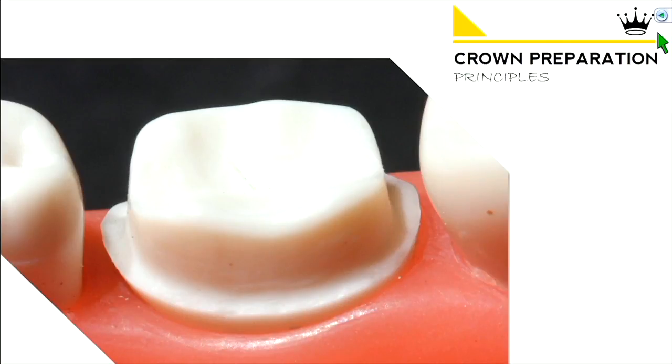Today we're going to go over crown preparation principles. How do we grind this tooth down? What are we looking at in terms of parameters, and what's the sequence in which we should probably do this?